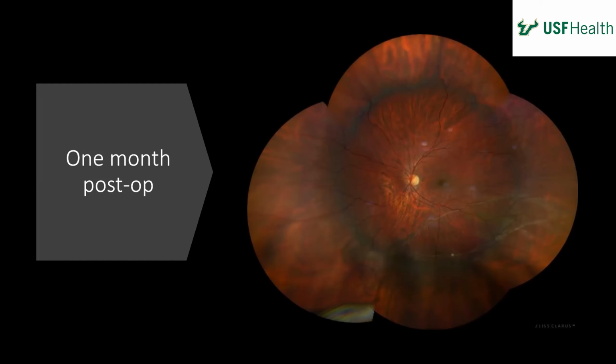This is an interesting older, younger doctor thing, but would everybody have drained this? Drain the subretinal fluid? I would attempt to drain it, but the subretinal fluid tends to be pretty thick because it's chronic. So I wouldn't be so adamant about trying to get rid of all the subretinal fluid. Basically, you want to just support the breaks, and it can take several months for subretinal fluid to subside. But what you're trying to do is prevent any further progression. So if you have the breaks supported, you should be fine.